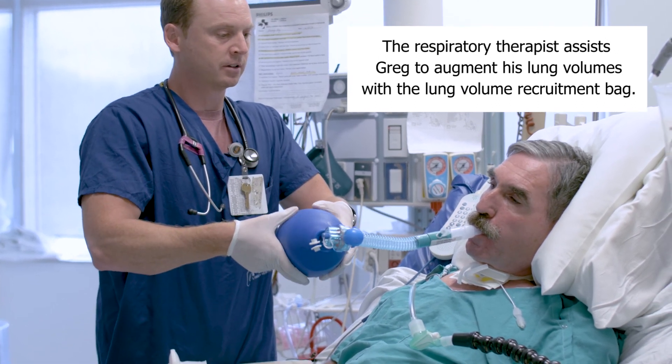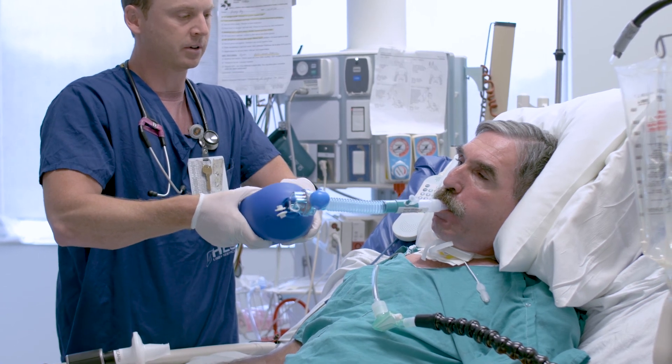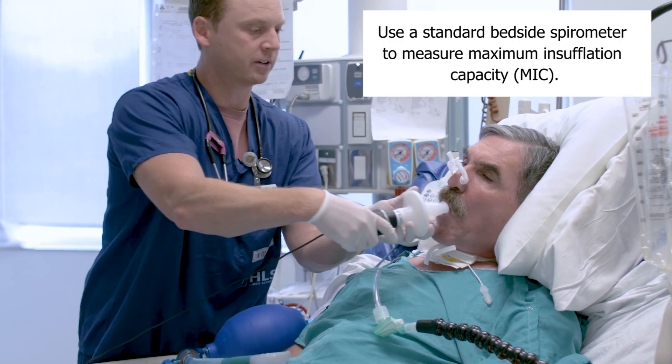Breath one, breath two, breath three, breath four, breath five — and breathe out.